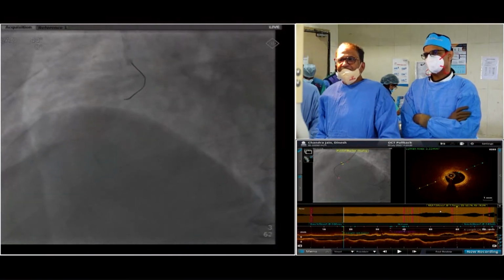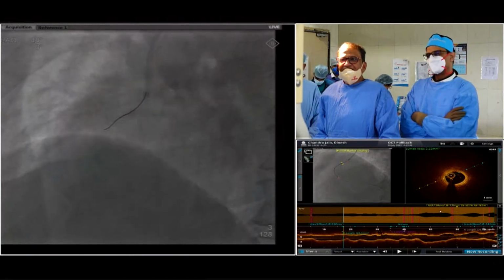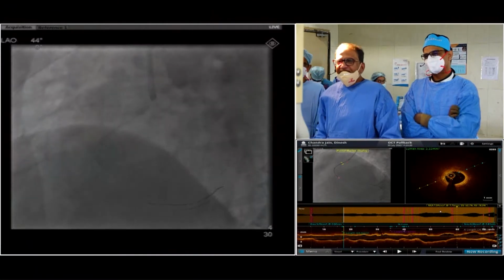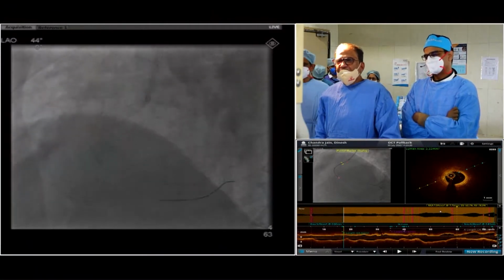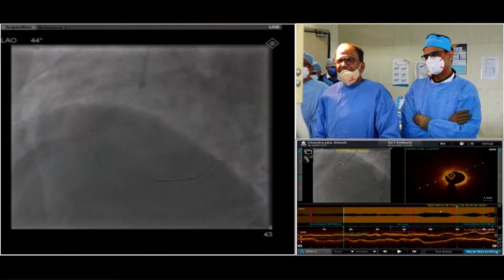I'll tell some tricks about Cyan Blue we learned from Dr. Swamy. He says that this wire is "baat karne wala wire", the wire that talks. I don't know how many people understand. And it really talks to you when you use this wire, so you should know how to use it. In fact, I've changed all my hardware to this wire.